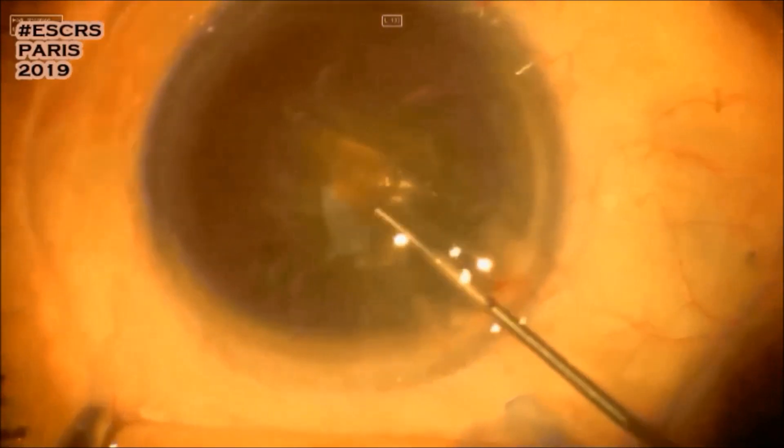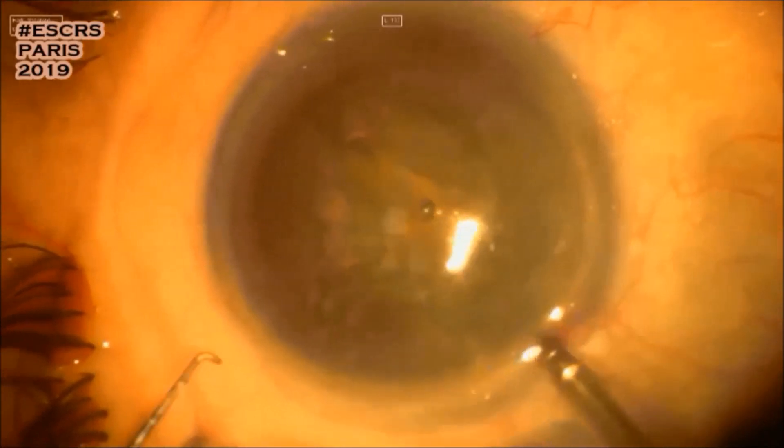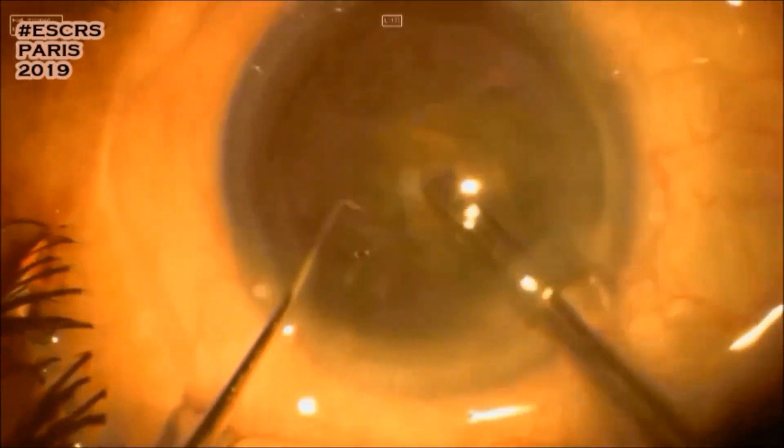Here we're protecting the endothelium with viscoelastic and the paracentesis is being made. Now it's time for some phaco. A 2mm phaco tip going into the eye, starting by cleaning up the anterior cortex.